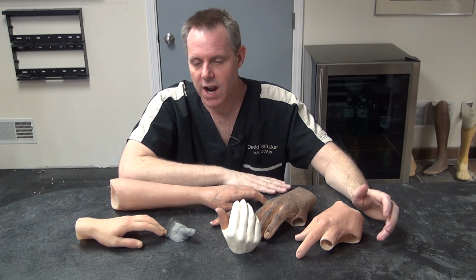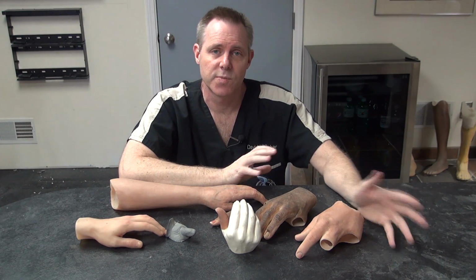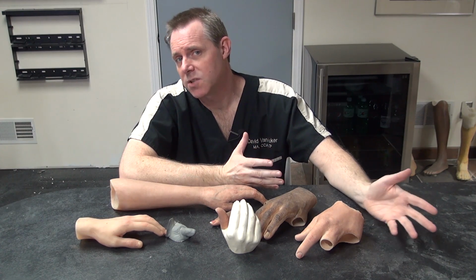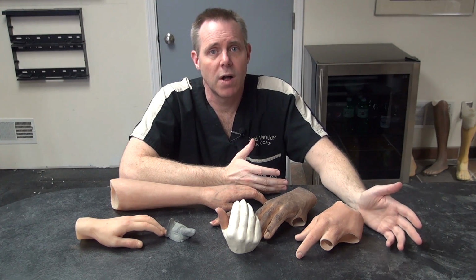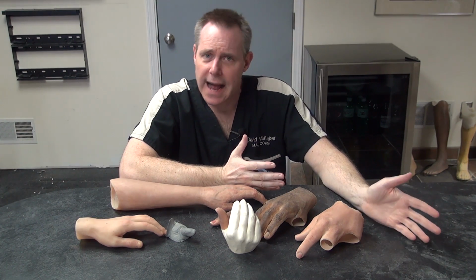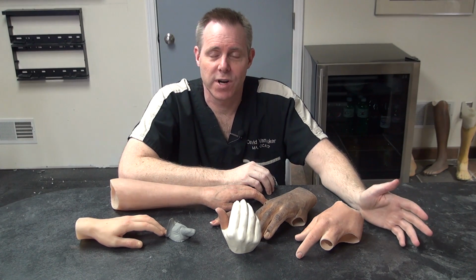We work with a variety of things here. We occasionally get requests for doing sports prosthetics. I've done devices for playing baseball, helping you to use your ball glove and play ball. I've done a couple of different golf prosthetics. I did one for hockey, archery prosthetic for somebody that wanted to shoot archery.